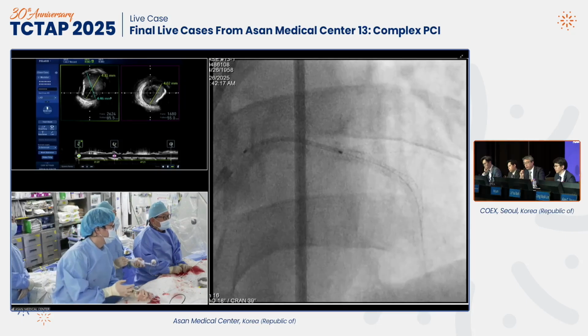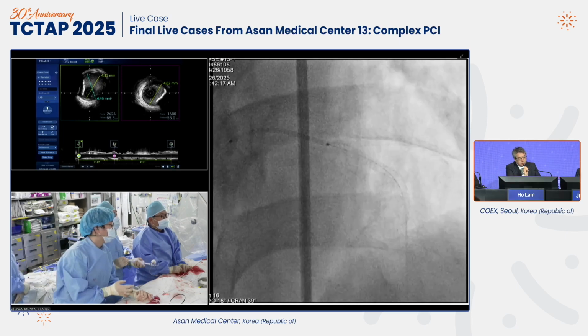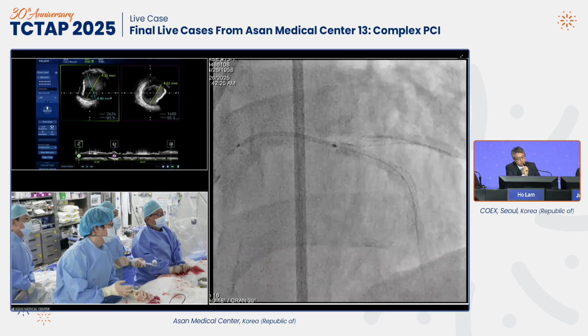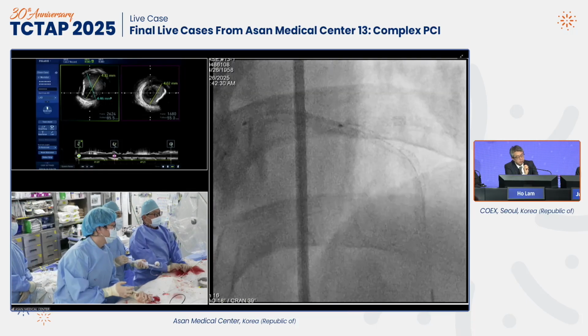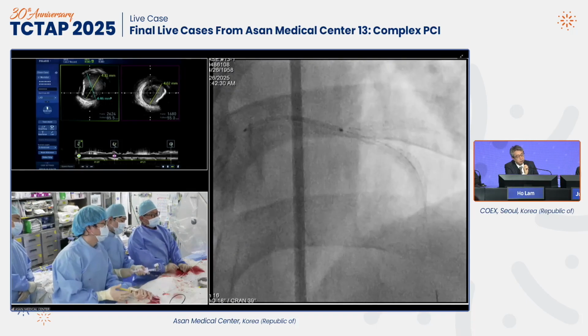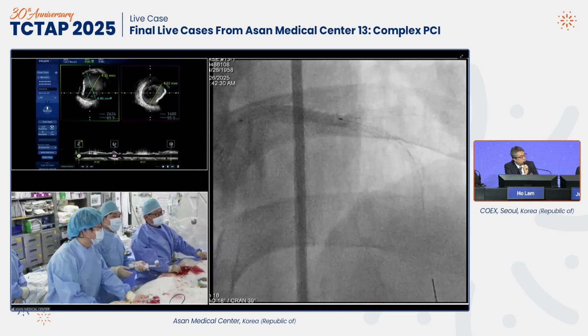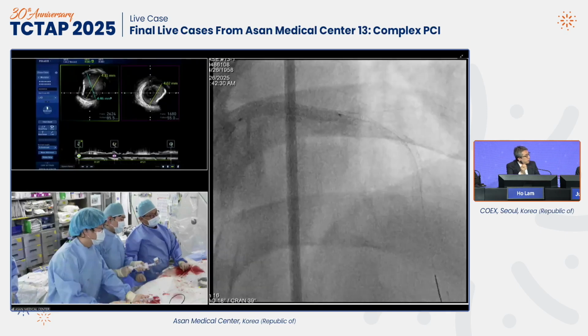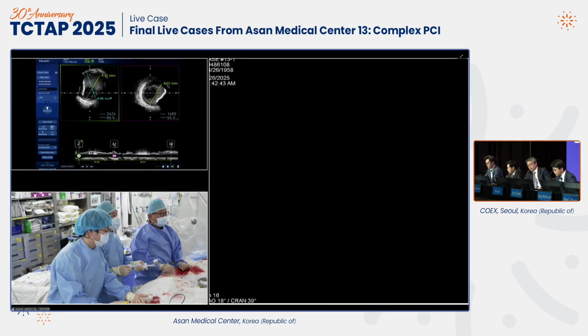Yeah, I think the angle you use for the left main stenting is very good. Although in classical teaching it's always said 20-20, most of the time I also find this angle. Actually, this angle is quite useful, and most cases can do left main stenting with this angle. 14, 16. Now main stent and deflation. Let's take an angiogram and have a look.